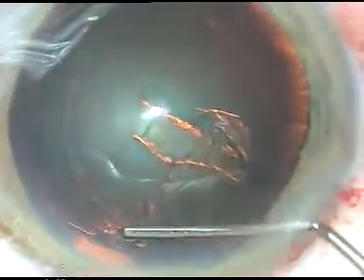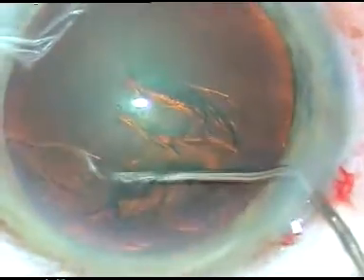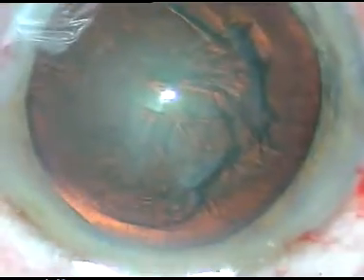Hydro-dissection has been done. Hydro-dissection didn't produce any golden ring in this case. The nucleus is depressed and rotated.